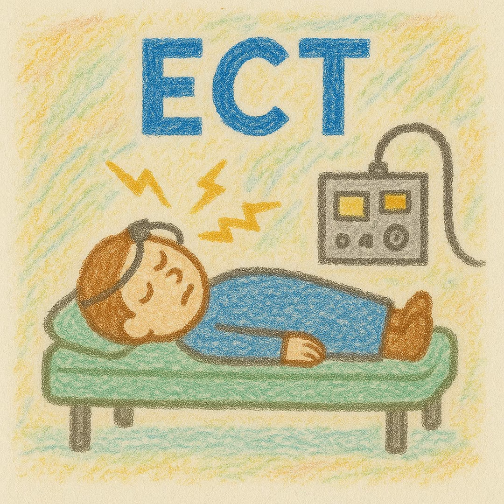Now, how do we change those? Most devices will have some options, some tables that give you guidance on that. There's basically two main device manufacturers in the United States that make ECT machines. There's Thymatron, and there's the Sigma device.